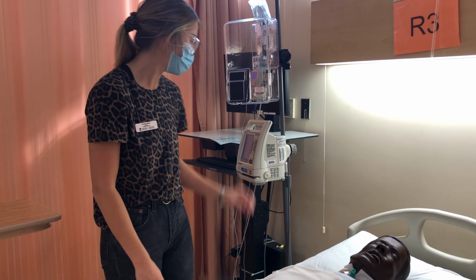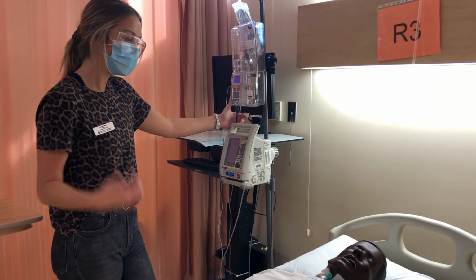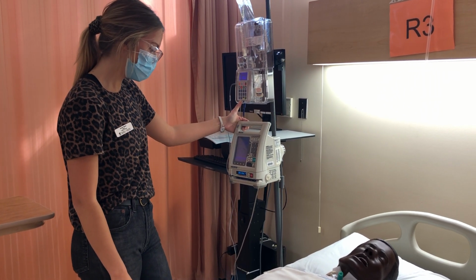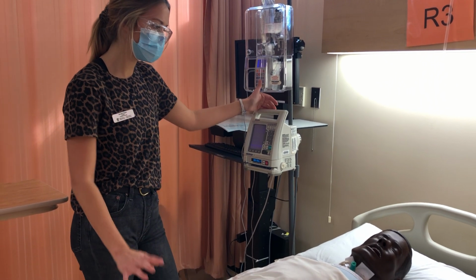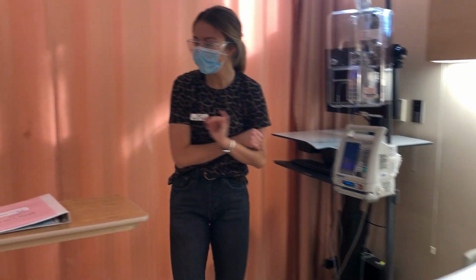If you can predict that you'll probably be going up to go to the washroom or something that's going to be more painful, you can hit the button ahead of time and then you'll get the medication. That should ease your pain. Do you have any questions regarding this at all? No, you're good, you're comfortable. So I do a safety check on the way out, and I would gather my MAR and all my supplies.